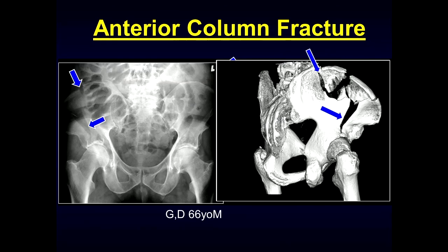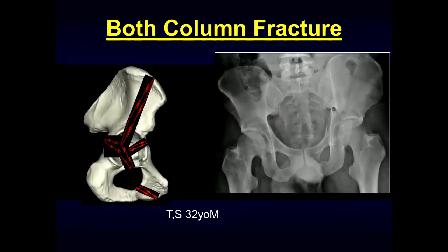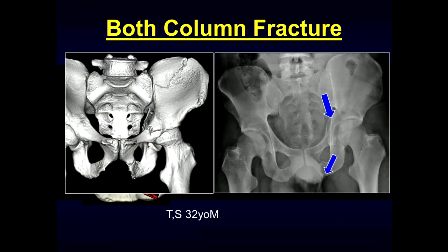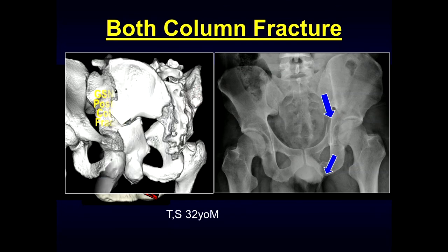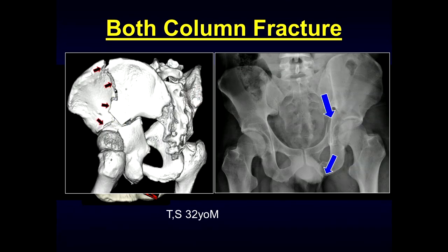You can also get both-column fractures. We see involvement of the acetabulum, the obturator ring, and on CT we can see the anterior column fracture as well as involvement of the posterior column as it involves the sciatic notch. Looking from the side, we can see the anterior column portion and then the posterior column fracture.